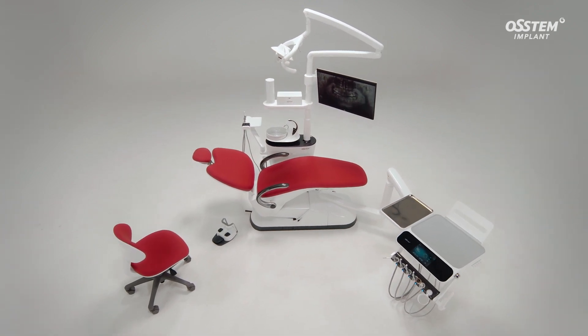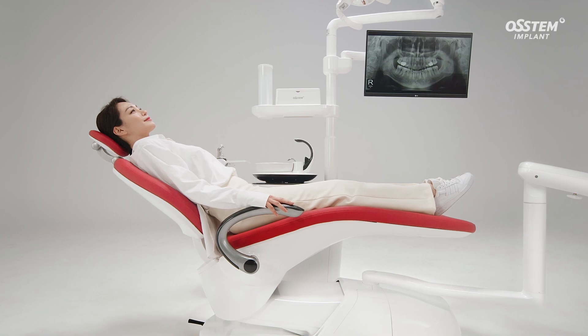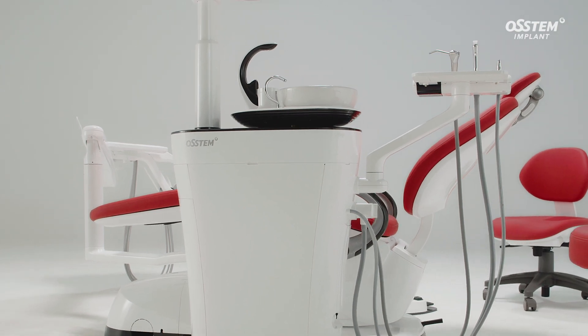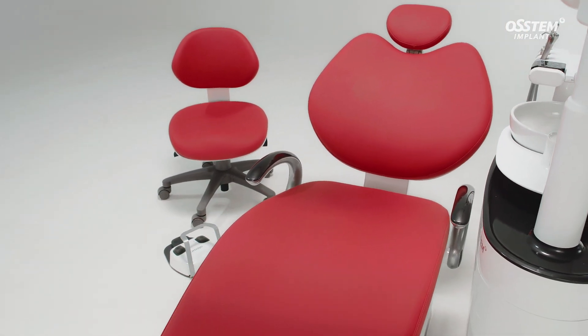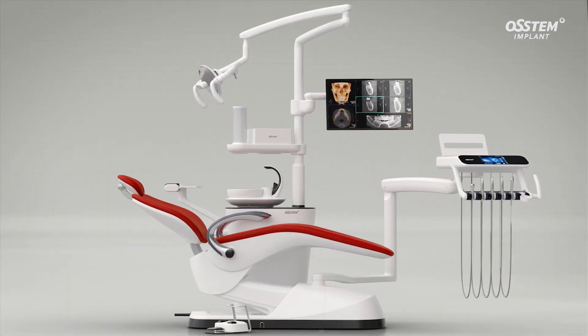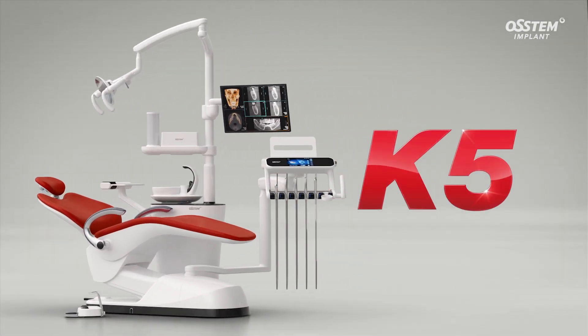Great unit chairs designed for dental treatment must be convenient for the clinicians to use, feel comfortable for the patient during treatment, and they should also be easy to clean and maintain. I would like to introduce the K5 as both a stylish and convenient unit chair.